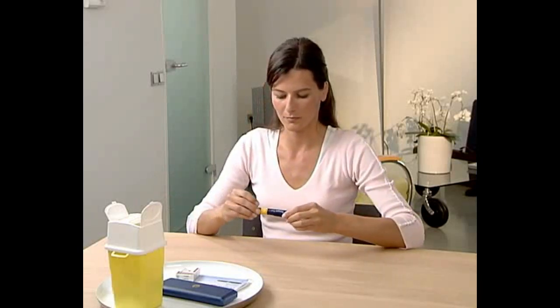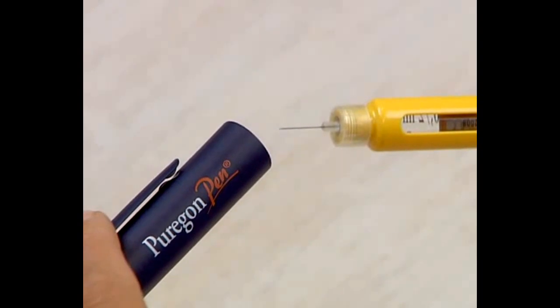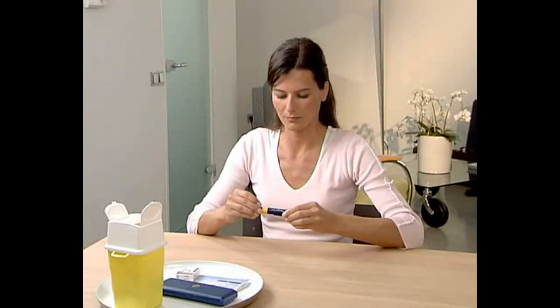After every injection, always take the needle off the pen. Never store the pen with a needle attached in order to avoid drug leaking and to minimise the risk of contamination. Put the cap back onto the pen.